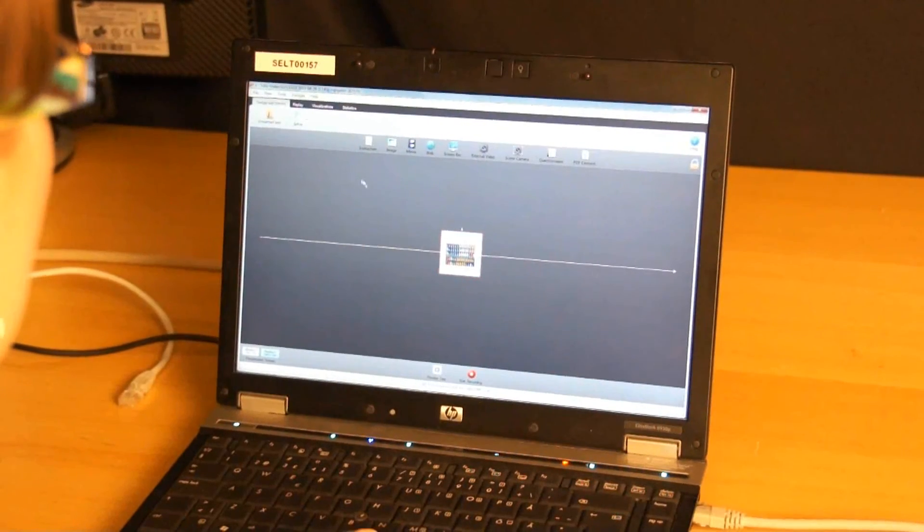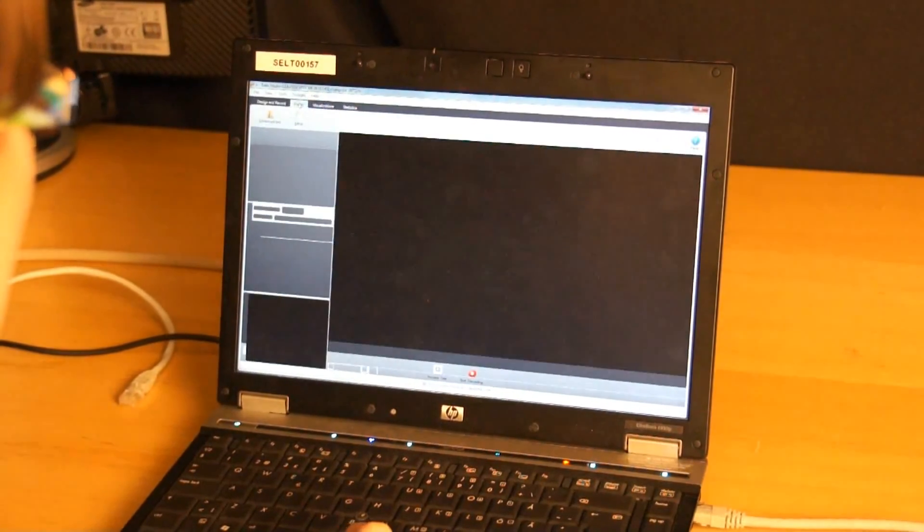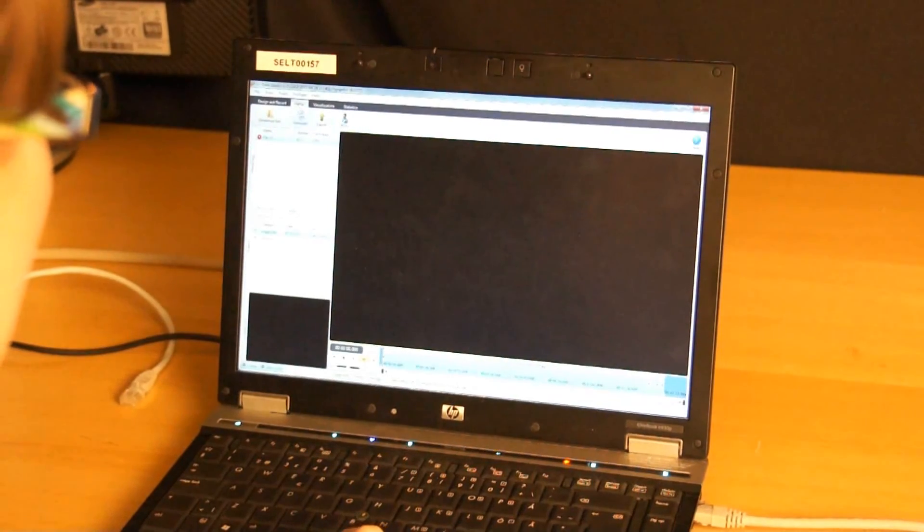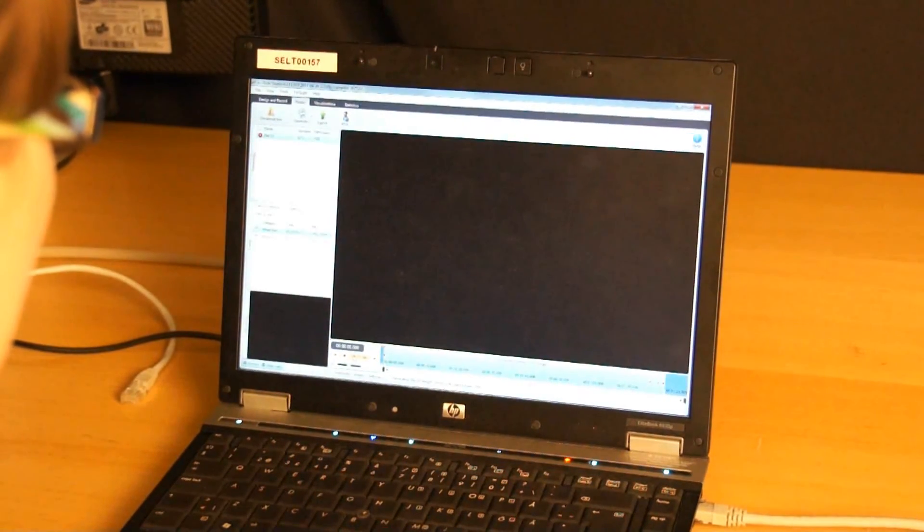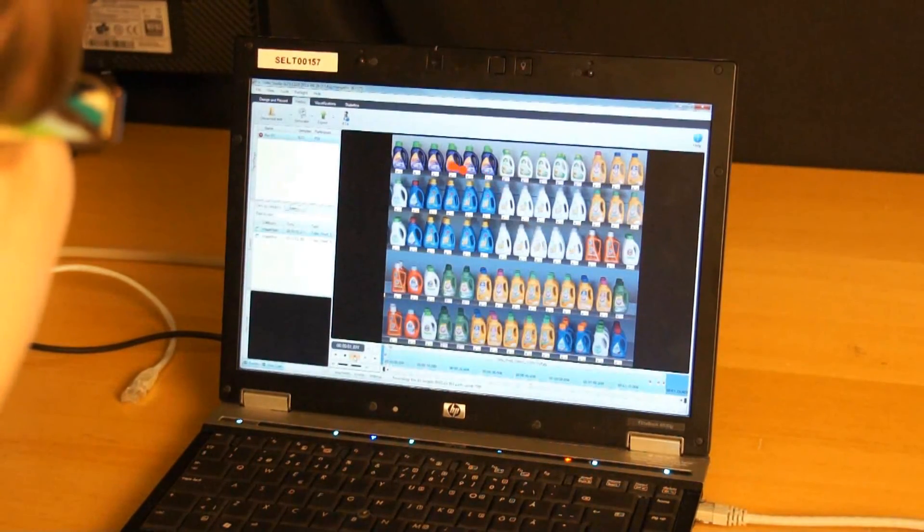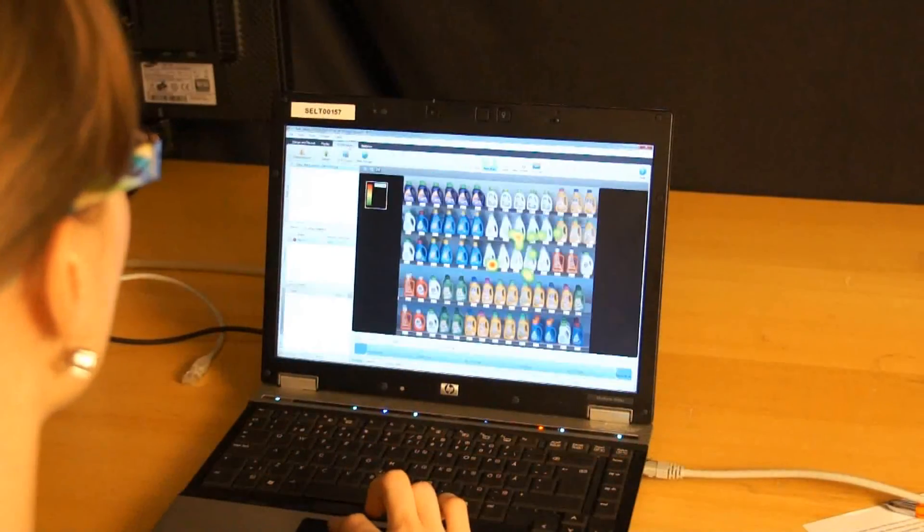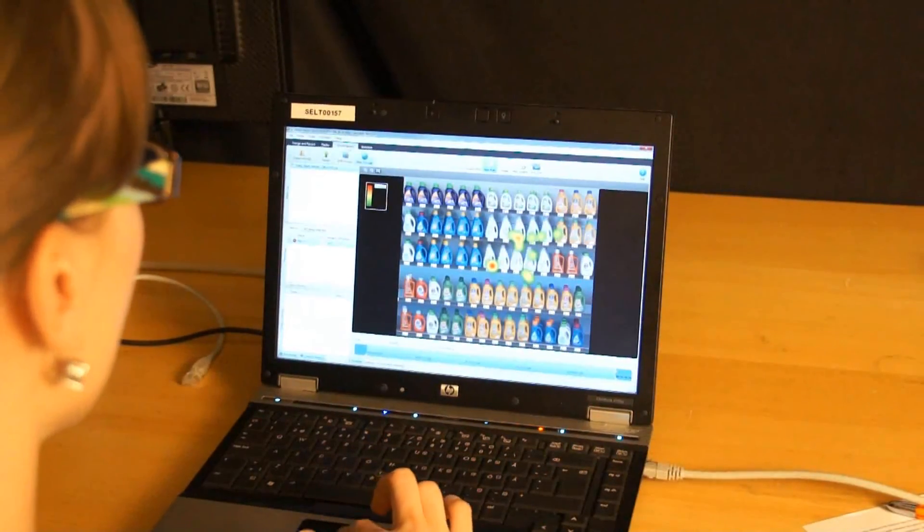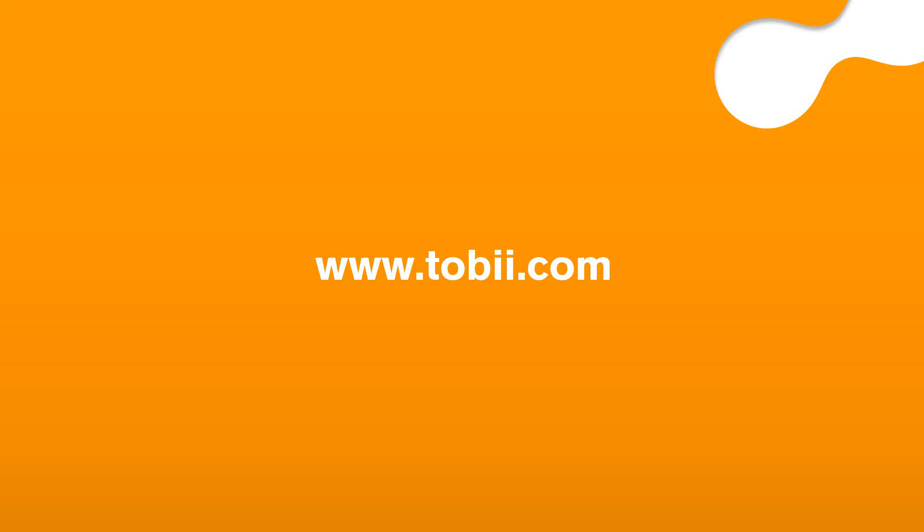After all participants are done, go to the Replay tab in Tobii Studio and select a recording from the left. Then click Play to see the recording. The collected data can now be interpreted or used for several visualizations within Tobii Studio.